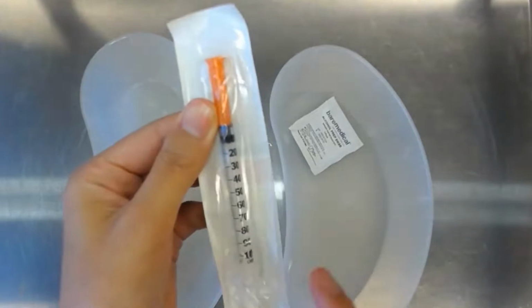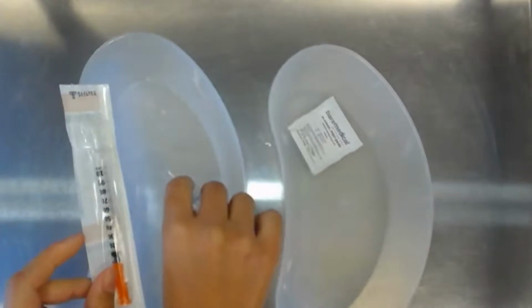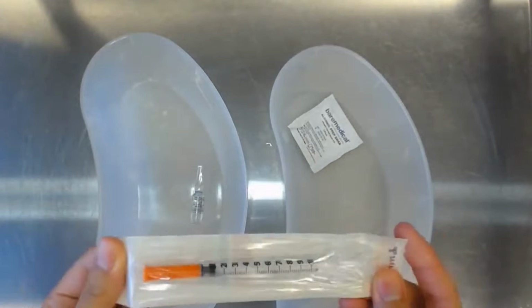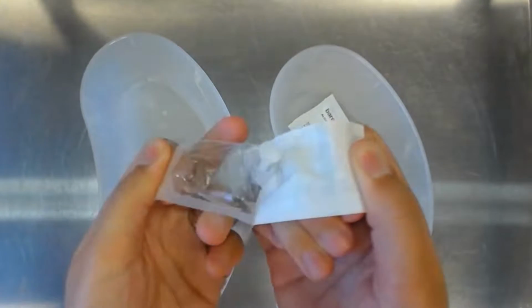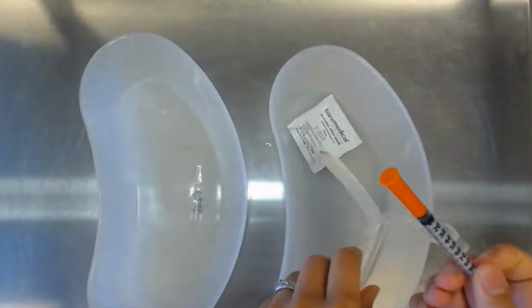Here I have the glass vial with the medication in there and an alcohol swab to clean the patient's skin before injection. The reason why I have 2 kidney dishes here is one is for the rubbish and the other is for specifically the sharps, which then have to be discarded into a sharps bin after the procedure is finished.